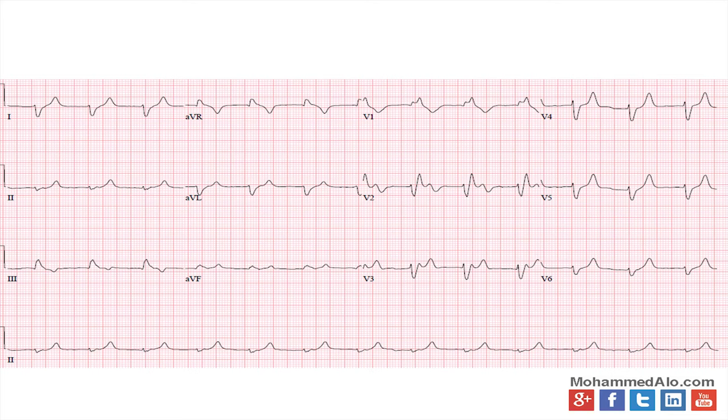So that's exactly hyperkalemia. That's what it does for you. It's an EKG diagnosis. You should never miss this, and you've got to be getting the patient's potassium down. Believe it when you see it. It's probably not hemolyzed. Get their potassium down with some insulin.